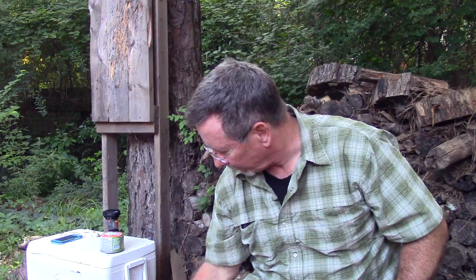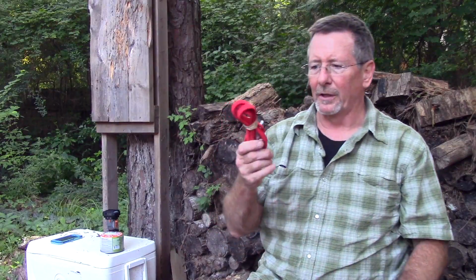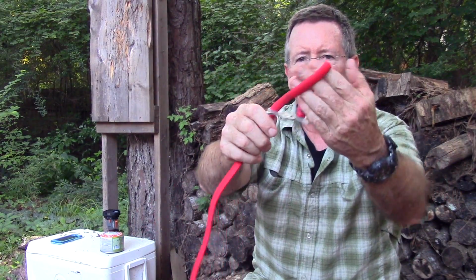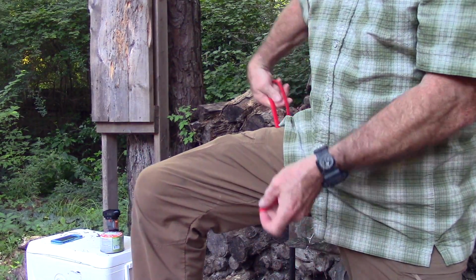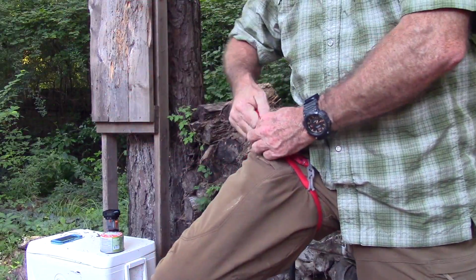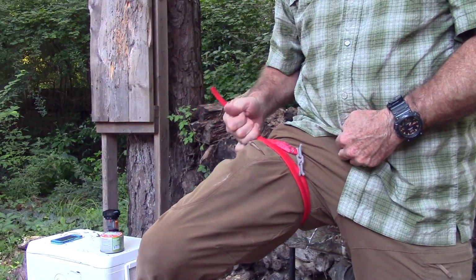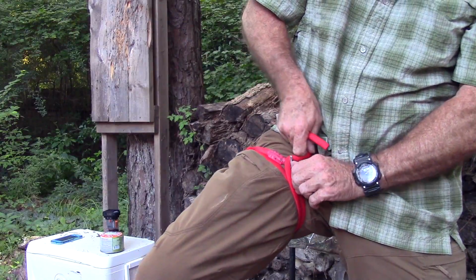So there's that one. The next tourniquet I bought was a RATS tourniquet, and it's an elastic style tourniquet. The way that works is you've got this 3-finger loop here, and to show you, put it on somebody's leg or your leg, you run it through the loop, and then you pull it back. Then you pull it really tight, as tight as you can get it, and keep it tight. You want to go around a couple of times, trying to maintain about an inch and a half wide band, and after you get it around, you hook it in here.